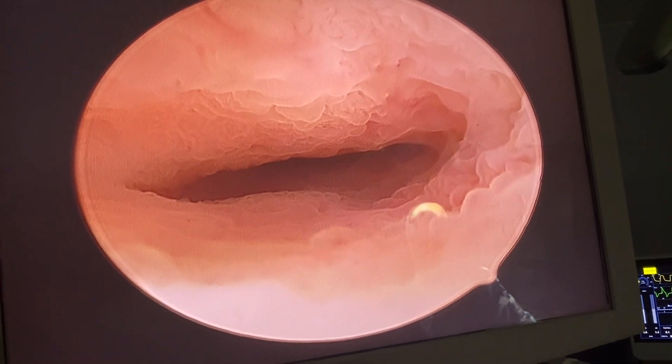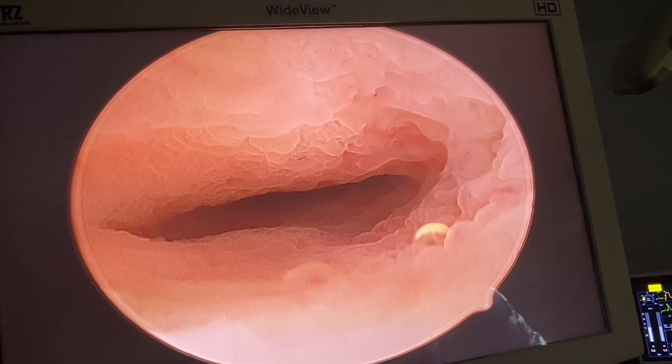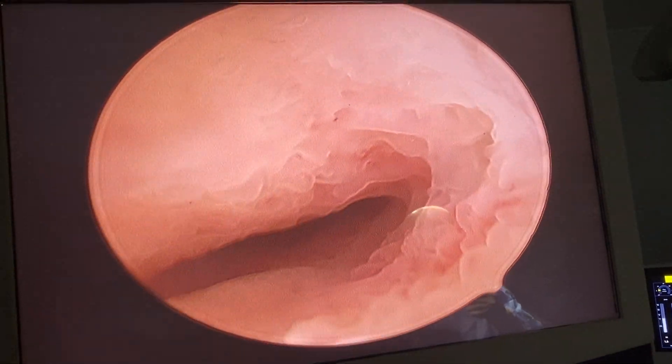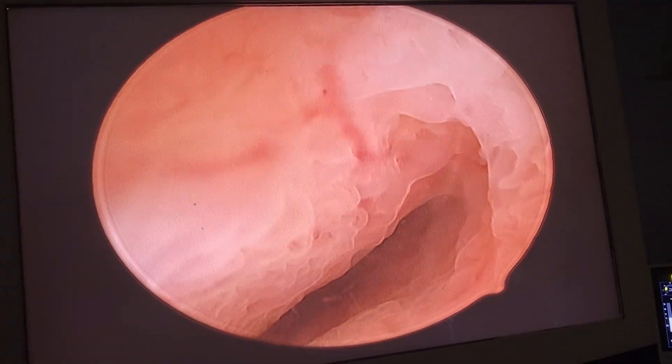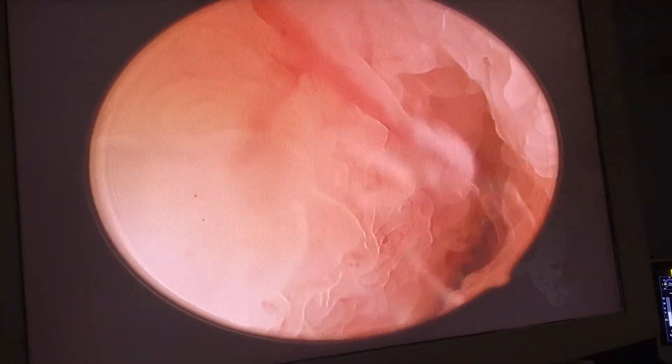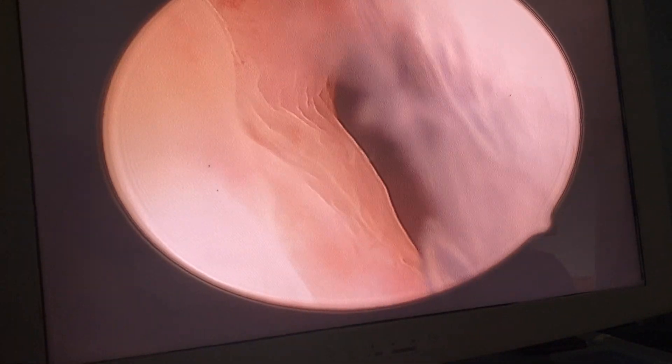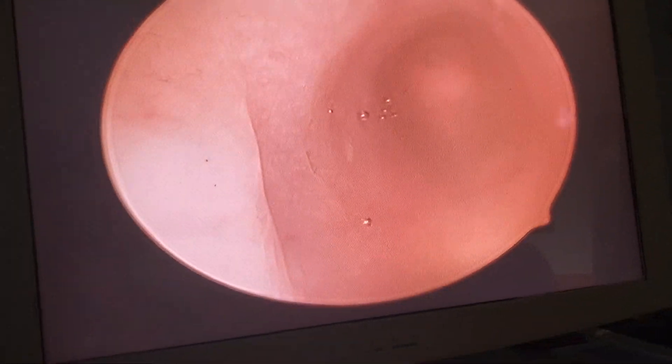I want to highlight a very important tip: the shape of the cystoscopy sheath is transverse, and the internal os is transverse too. So don't try to go like this — rotate and glide on the anterior wall. Give a chance to follow the black hole. I'm gliding on the anterior wall and then we are in. I read the focus.